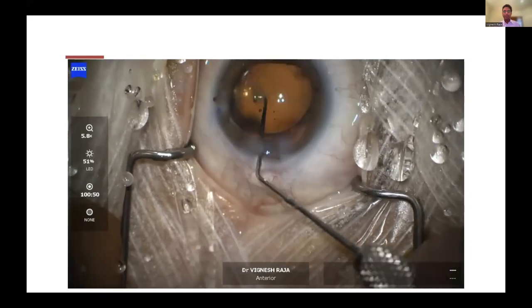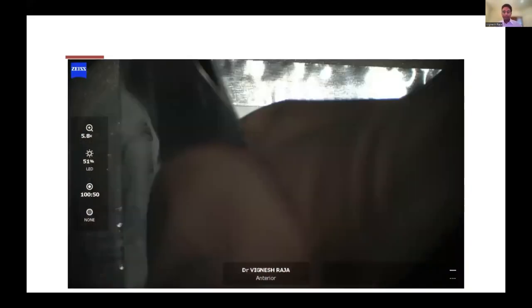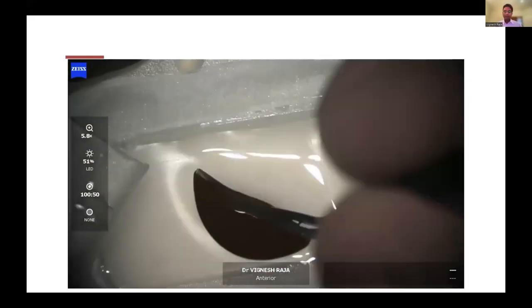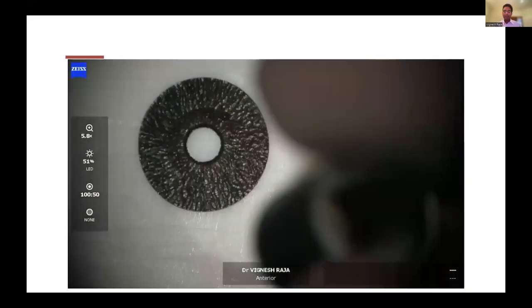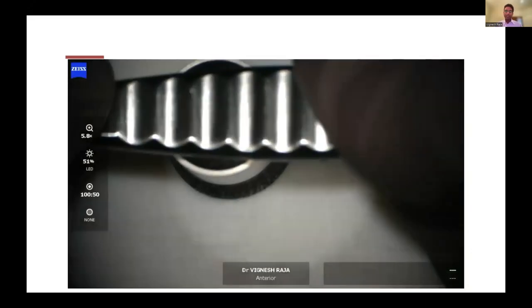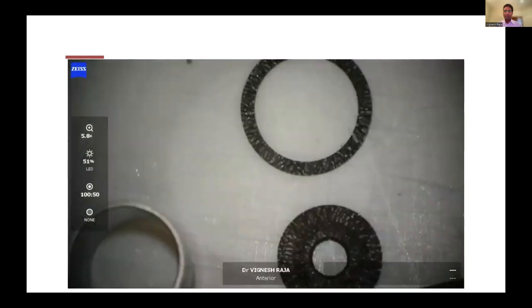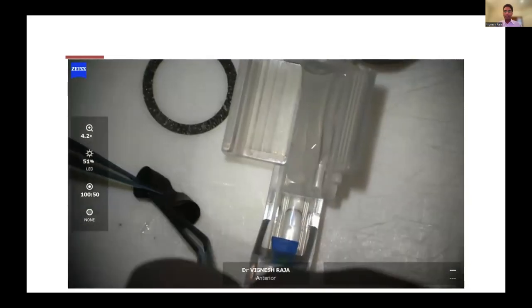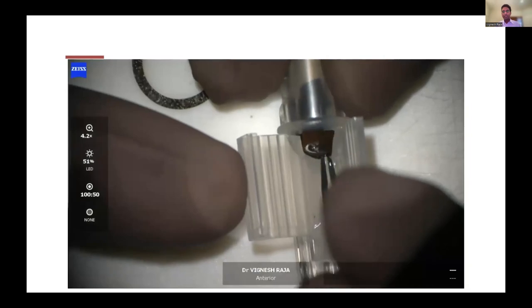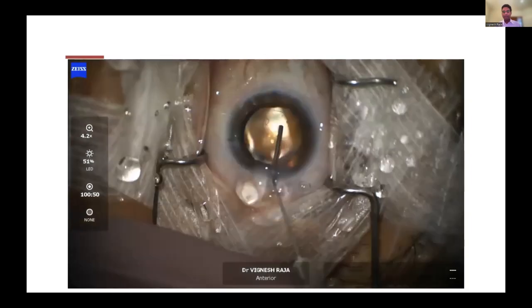You can see the rhexis margin overlapping the lens now. And here is the fiber-free artificial iris. This comes in standard brown, or you can make it custom made to match the patient's fellow eye. Here's the trephine. You press with the trephine with the Mufil's forceps on top so that you get a nice ring all around. And here I'm injecting it; the other side of the iris prosthesis is just dark black in color. So here I'm loading it into the injector, and I'm expanding the capsular bag nicely.